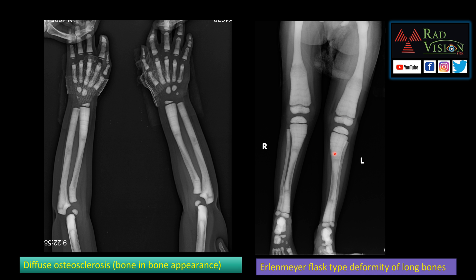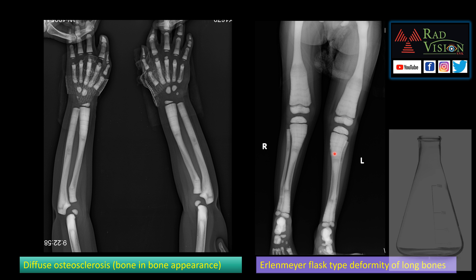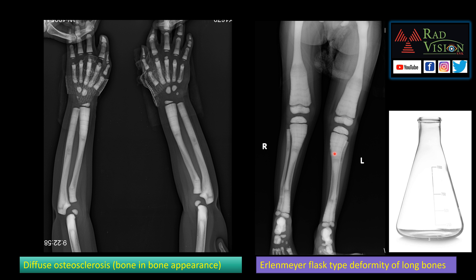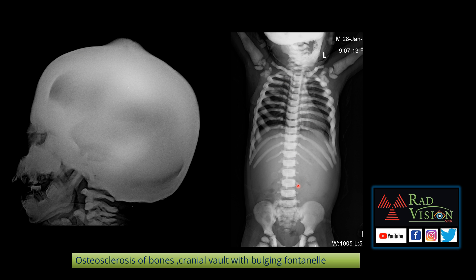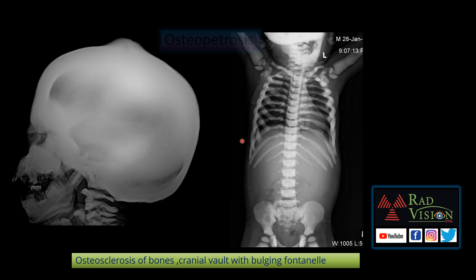This is the classical Erlenmeyer flask deformity of the long bones. In the same case, you can see diffuse osteosclerosis of the skull vault, and even the visualized vertebrae, ribs, and pelvic bones, along with a bulging fontanelle.